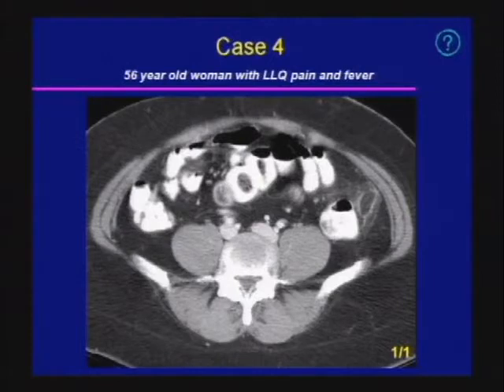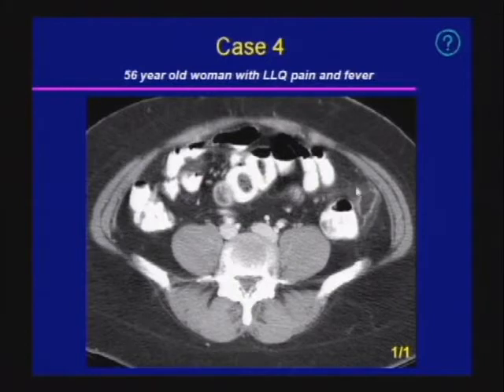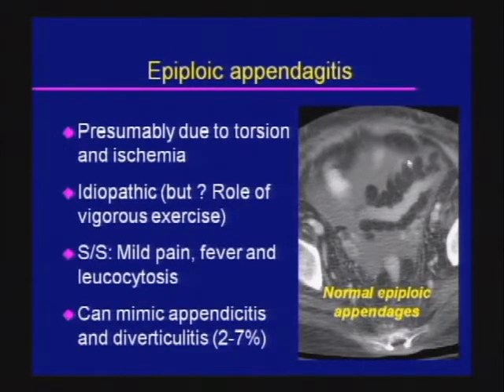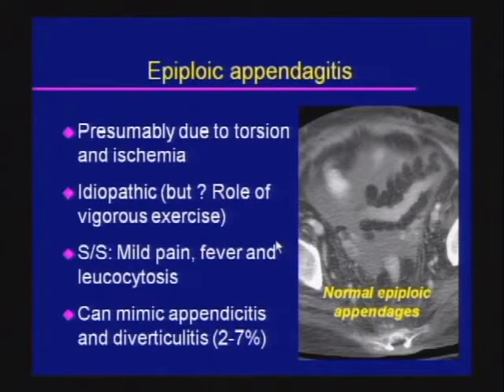Case four: we see a fatty mass with surrounding hyperdense enhancement and pericolonic inflammation in the left lower quadrant. This location is classic for epiploic appendagitis. Normal epiploic appendages are fatty fingers arising off the intraperitoneal portions of the colon. It is thought that appendagitis is related to twisting or torsion leading to infarct of the appendage, and exercise may contribute. There is no known definitive cause.